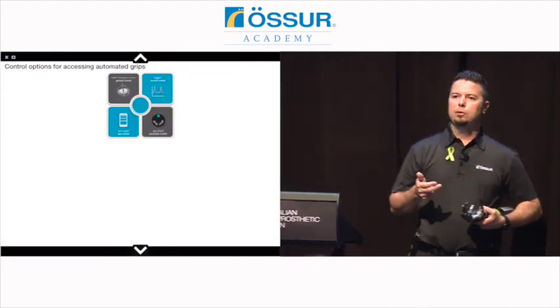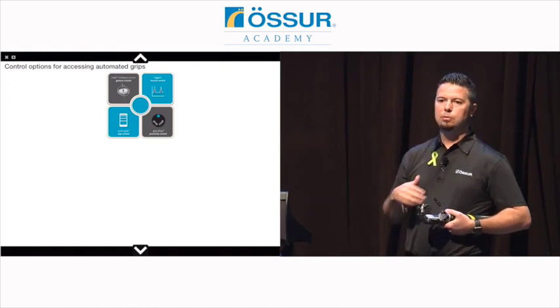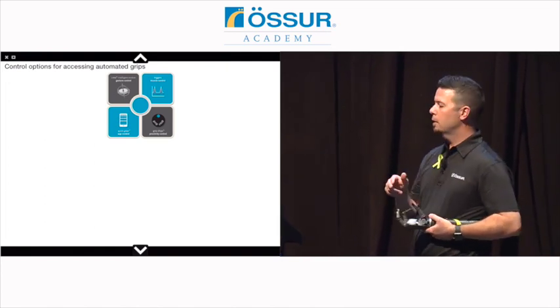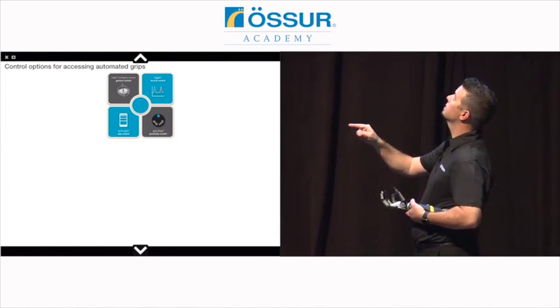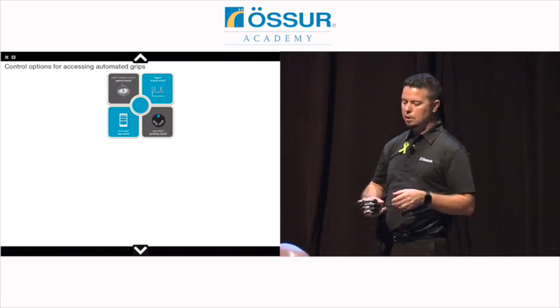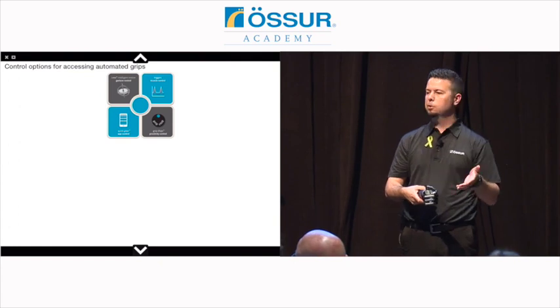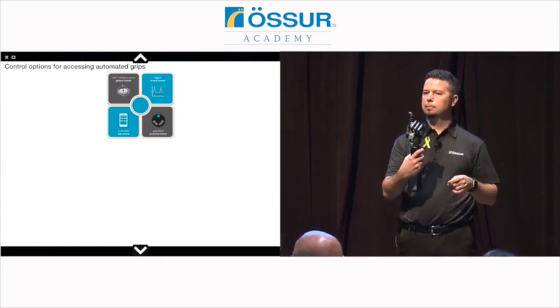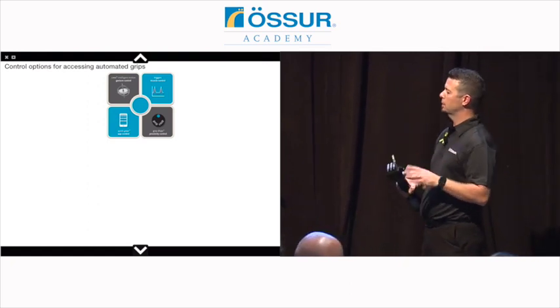And then the way you get into grips with our hands are illustrated with this icon that you'll see throughout the presentation, throughout the training suite, in your notes as well. And they illustrate the different ways that a user like Nathan can access grips. The first in the upper left is gesture control. Gesture control is what Claudia was using, where she sustains an open signal, a finger twitches, and then she moves. The hand's going to enter a grip. It's really easy, really simple. You get 4 different directions of motion to get 4 different grips.